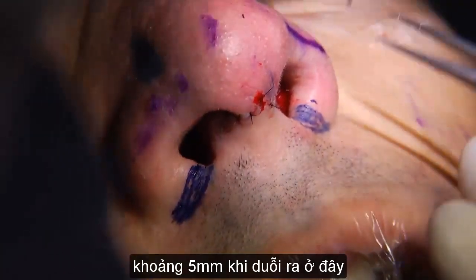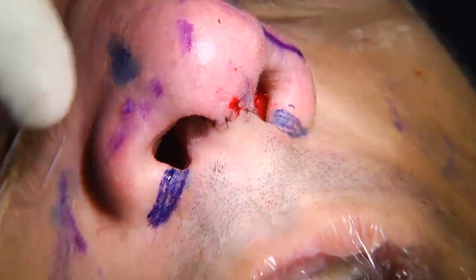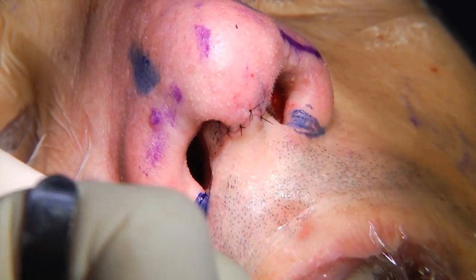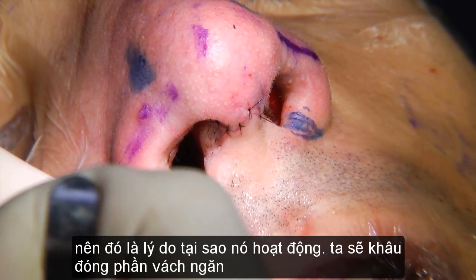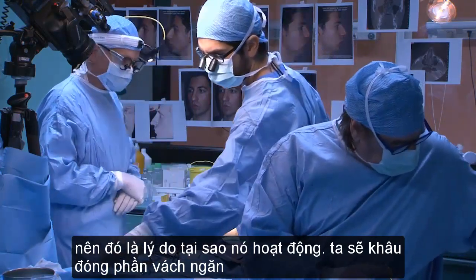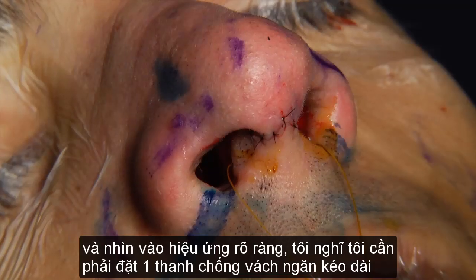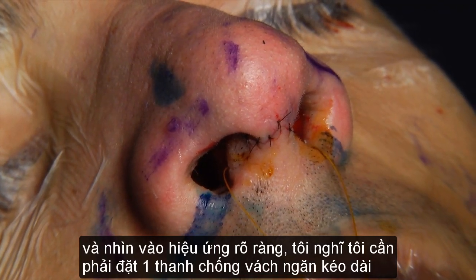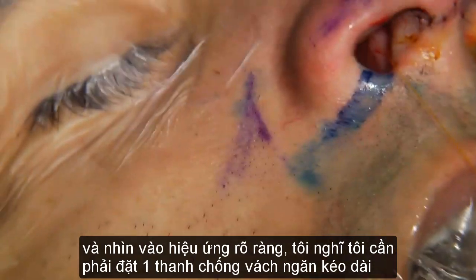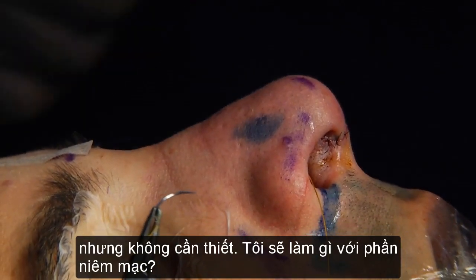It's about 5 millimeters on the stretch here. So while this is working, let me just close the septum. So you can actually see how much this thing was hanging and see now the obvious effect. I thought I would have to put a septal extension graft, but a septal extension graft was not necessary.